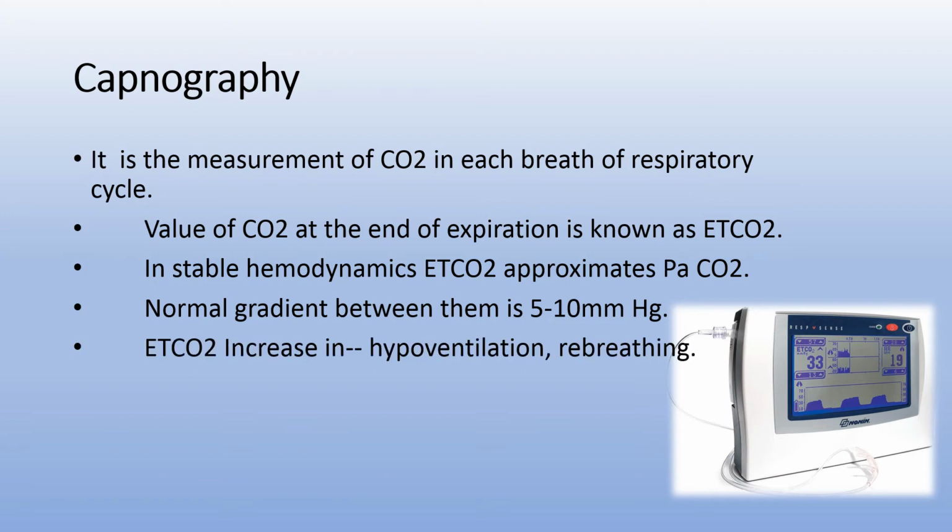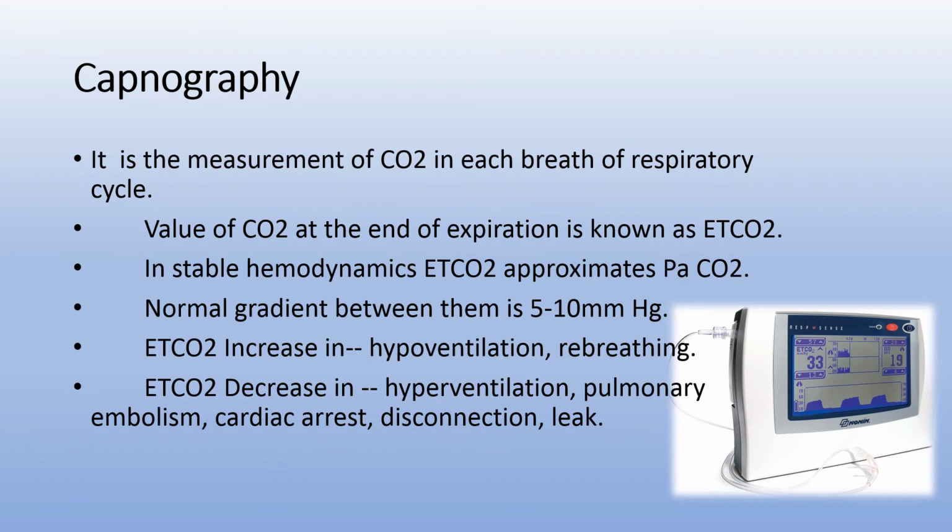End-tidal carbon dioxide increases in case of hypoventilation or rebreathing. And end-tidal carbon dioxide decreases in case of hyperventilation, pulmonary embolism, cardiac arrest, disconnection, or leak in the circuit.